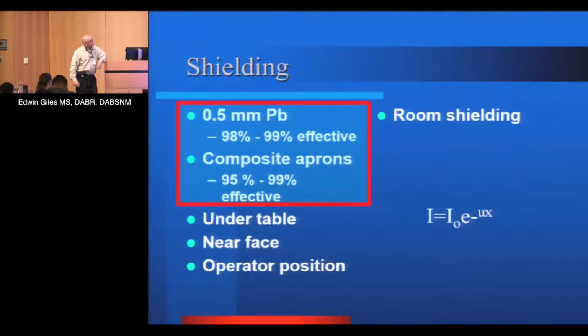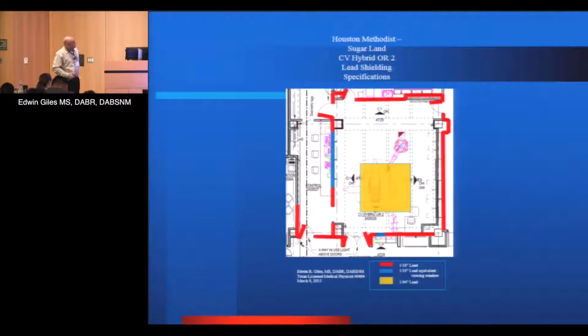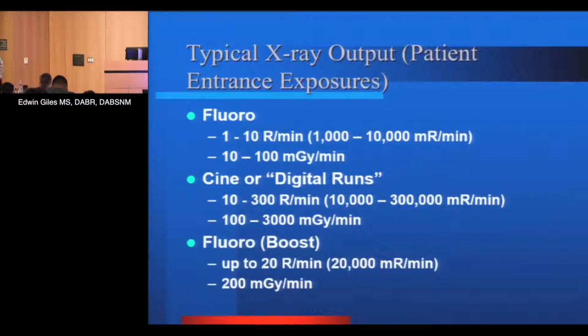The most beneficial, as we mentioned, is lead aprons. We're looking at 98 to 99% effectiveness. Any X-ray room in the hospital has lead shielding. The exception to that would be in certain rooms where you bring in a portable X-ray unit, right, or a portable C-arm. So certain ORs where you bring in portables, there's not lead in the walls. A dedicated room will have lead in the walls. As an example, the lead in the walls is usually about 1/32 or 1/16 of an inch of lead, which correlates to about 0.8 or 1.6 millimeters of lead. So we're talking about very thin amounts of lead, but then the effectiveness of this is significant as far as reducing the exposure to any adjoining X-ray rooms or operating rooms.